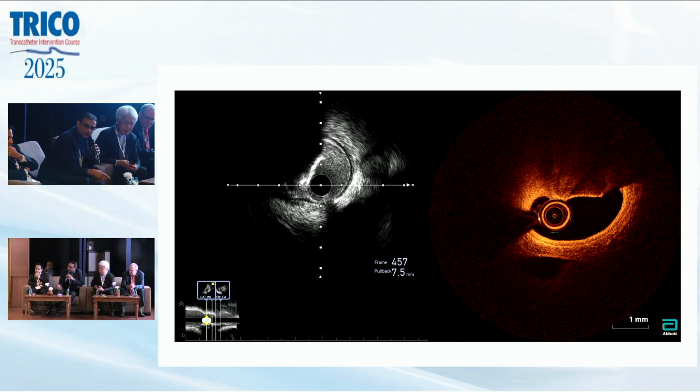Yeah. What used to work best for us was a rota followed by a cutting balloon followed by a rota with a bigger burr. This was done in the days before we had IVL. And sometimes the bias is not good enough for the burr to go through the area that we need. So when you do a cutting balloon after a rota, we don't fear dissections, and we go back in with a bigger burr, and that seems to create the best kind of area that we have.